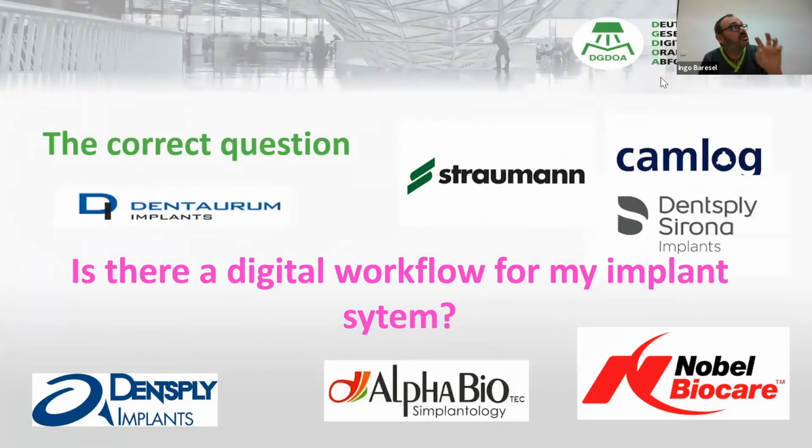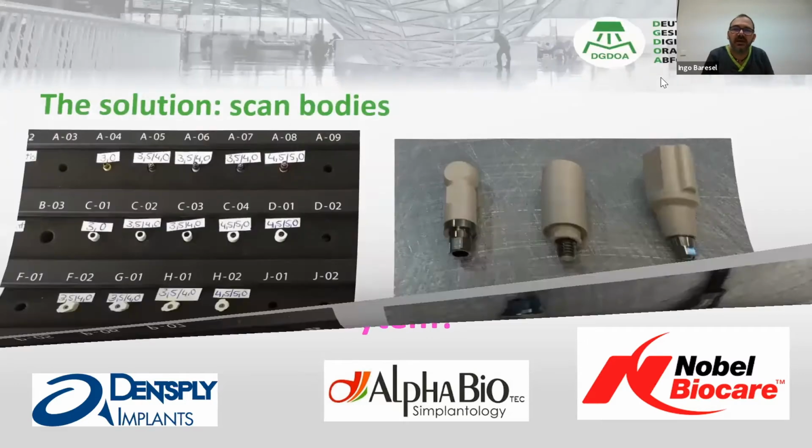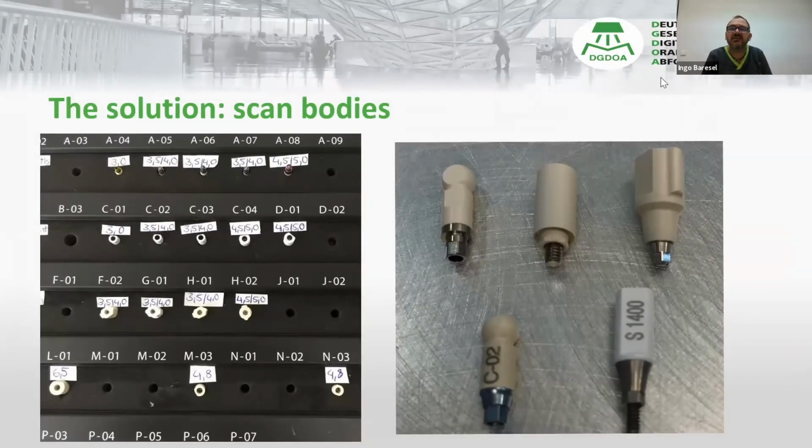The important question is not, is the scanner able to scan implants? No, the question is, is there a digital workflow for your implant system? This is offered either by the original company which produces the implants or by third-party companies. For most of the implant systems now, there are digital workflows, but please talk to your lab because they need the libraries for those scan bodies.